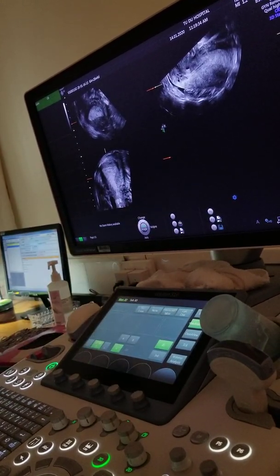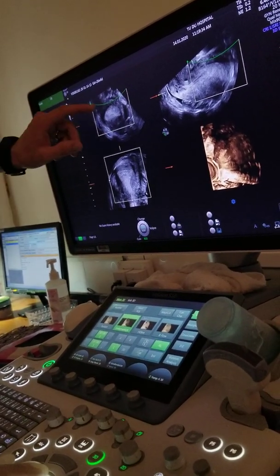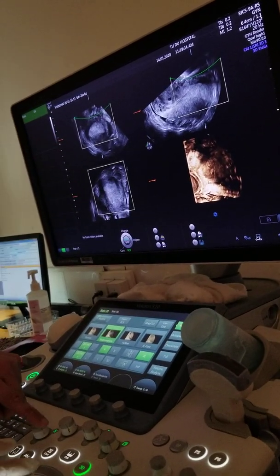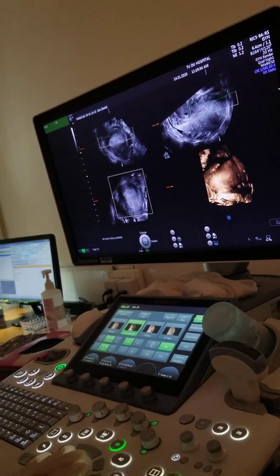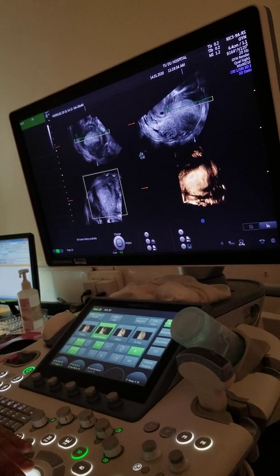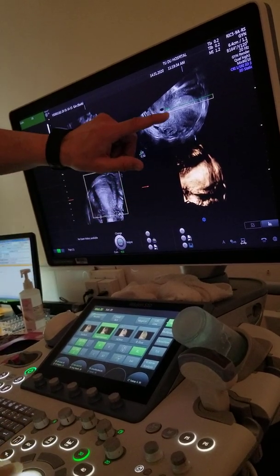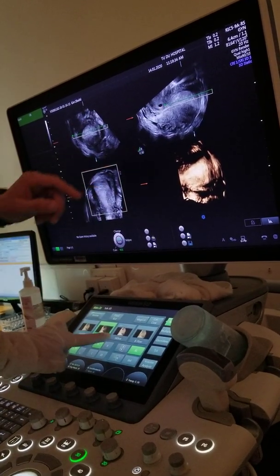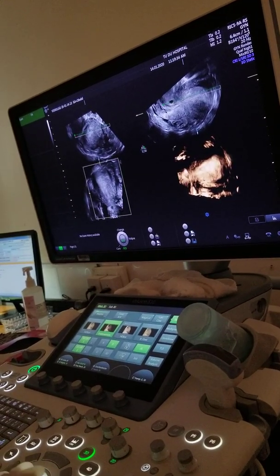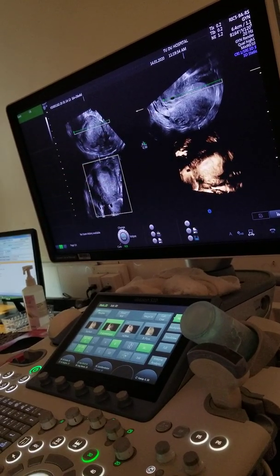So you go back to these to see the three. Render. Now you get the box. It's already on top. It's fine. So you make it go to A. Make it very tiny. So you change from the top. Small, small, small. Yeah, and probably put it right on top in the middle. So you see, I am cut here. Why? Because I'm only to here. So you can go to B and make it longer. You can hit to change. Longer, longer, longer, the maximum. So that's the maximum here.